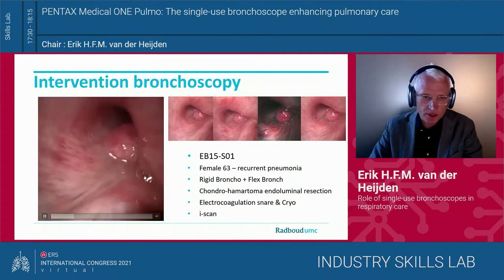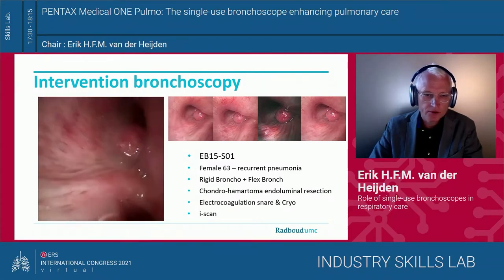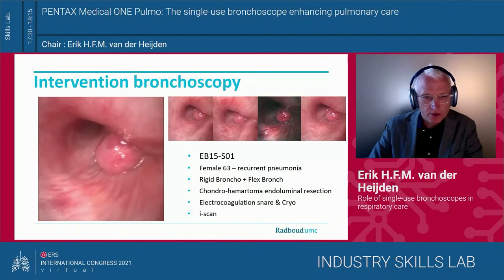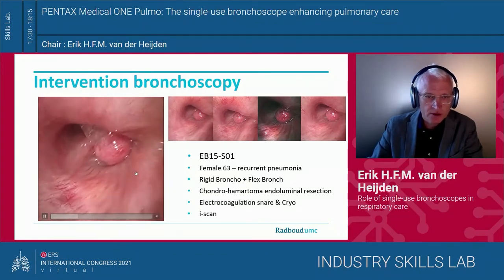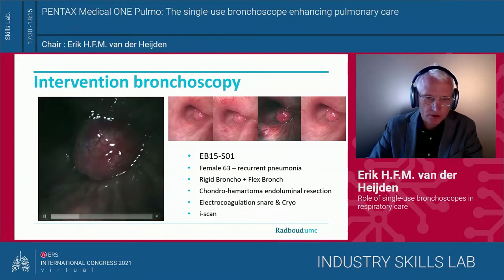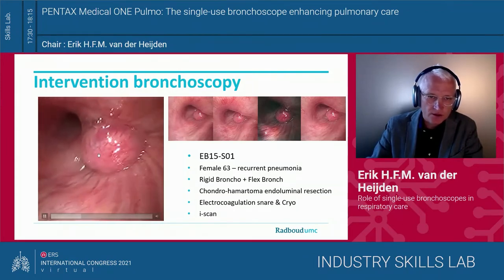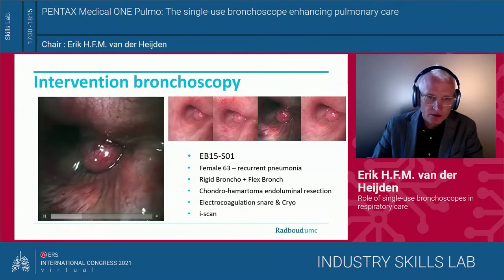We didn't have a diagnosis to start off this procedure, so the referring hospital took a biopsy from this, well, polyp. It moves around with the ventilation, as you can see. You can see a bit of the vasculature on top of it. And this is the eye scan mode, and you can see the vessels a bit better. So these are the vessels.